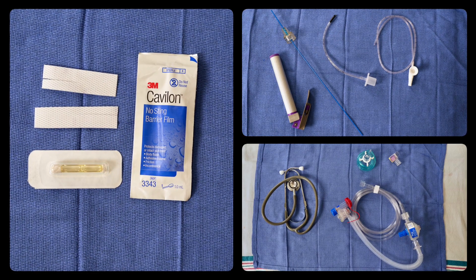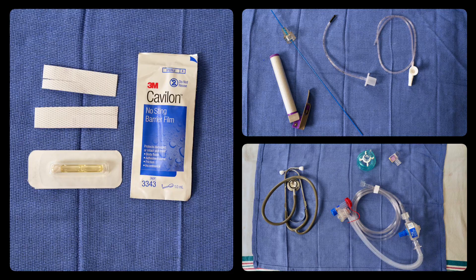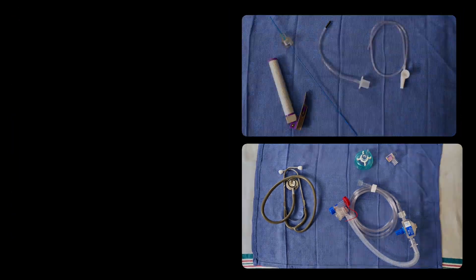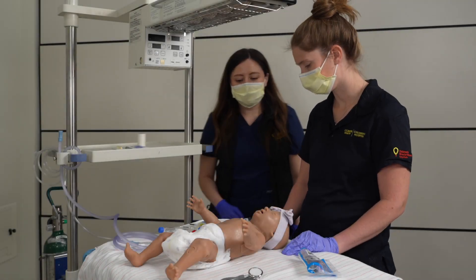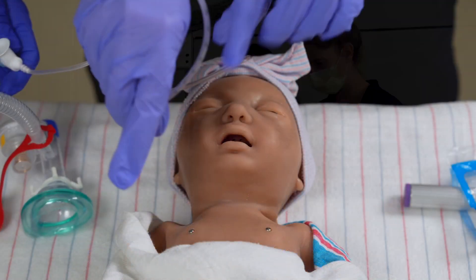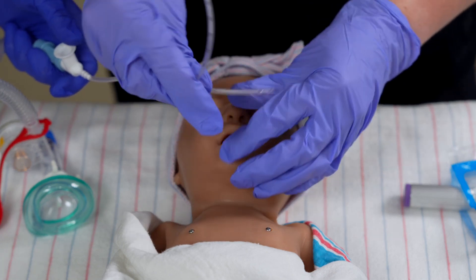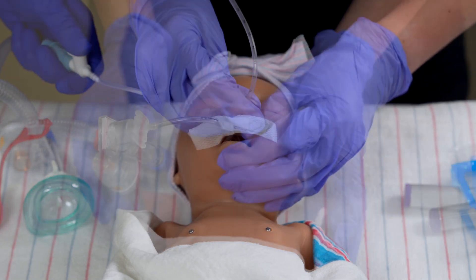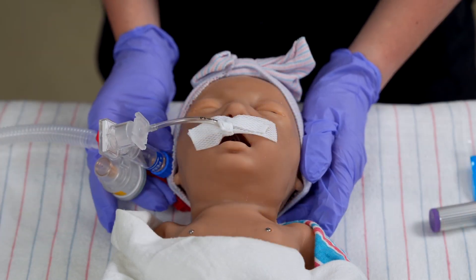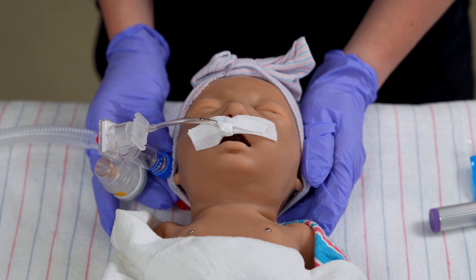Gather and prepare all necessary supplies for the provider. Verbalize vital signs to the provider during the procedure and assist in suctioning the infant when requested. Assess for placement and secure the ET tube with tape.